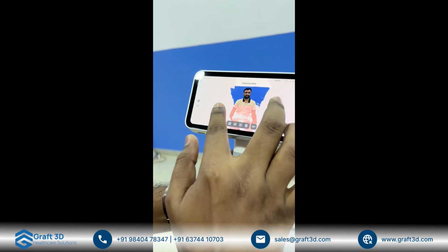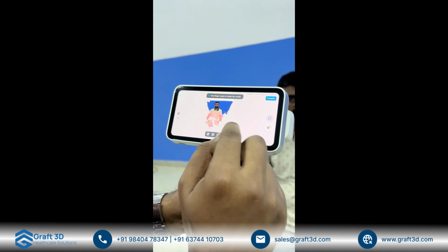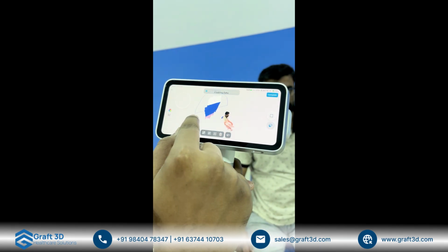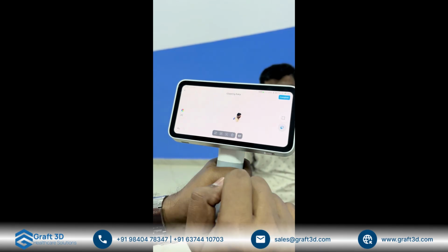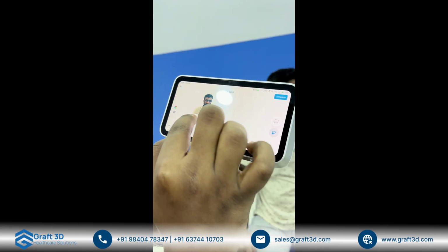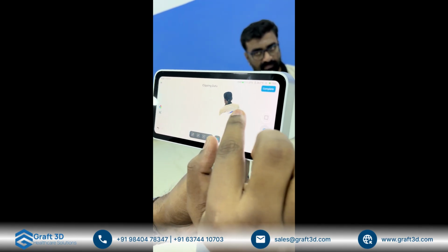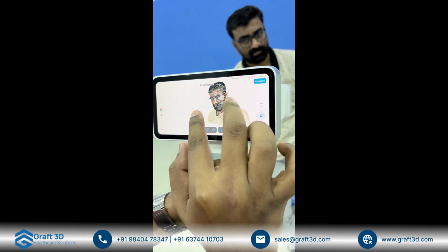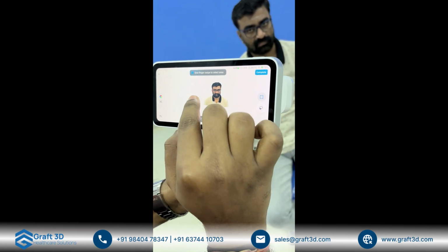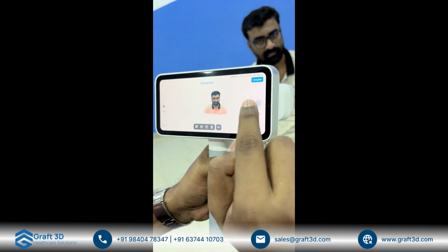I'll just select this. I'll select the bottom part as well. Okay. I'll rotate the model a bit. I can go on the laser select. I can just select this part. I'll delete this part. Now if I want to rotate, I can just rotate it like this. So you can appreciate the scan data and the texture data as well. If I want to delete some more part, I'll select this and I'll click on delete.